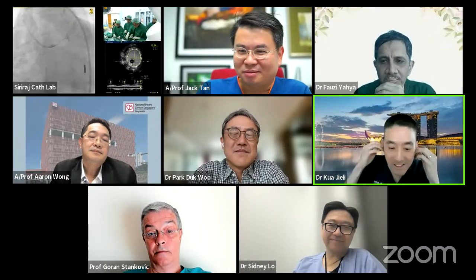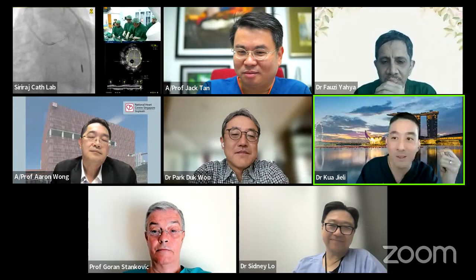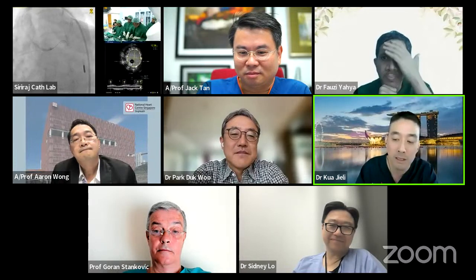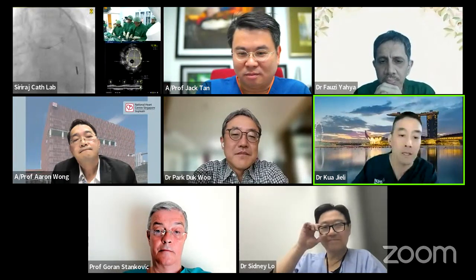Hi, Jack. Yeah, I'm not dead. So definitely, I think imaging for me is still important. I think with a lot of post-PCI imaging and physiology, basically what we are trying to do is have more objective measures at the end of the process, to know that you've done well.